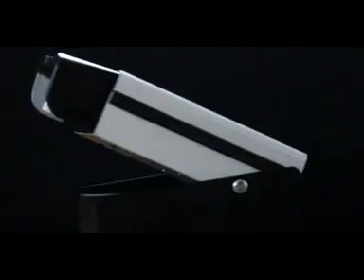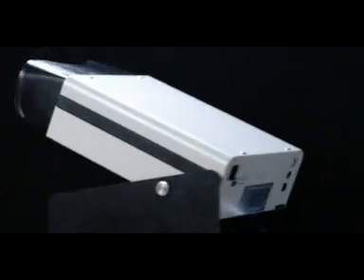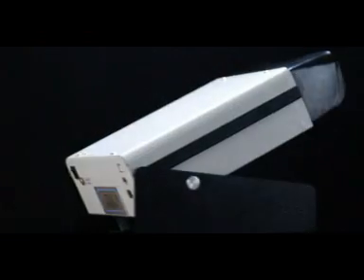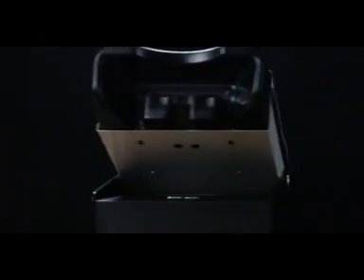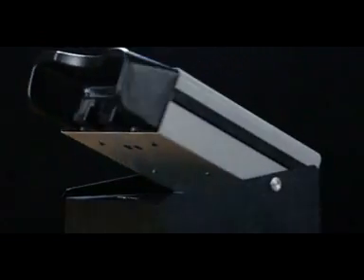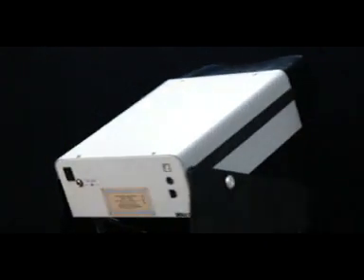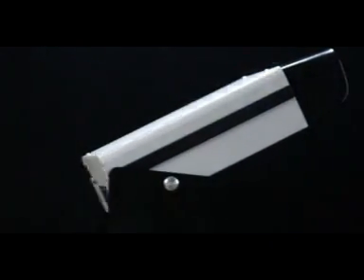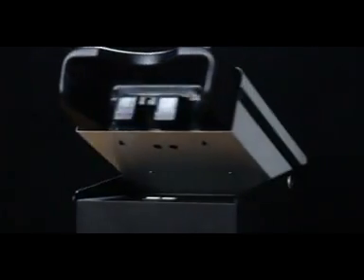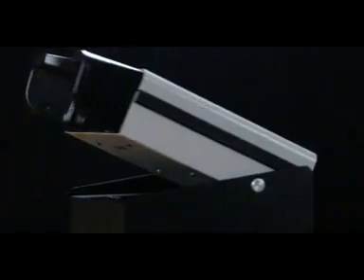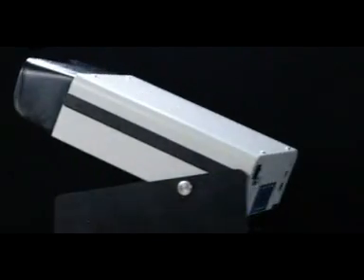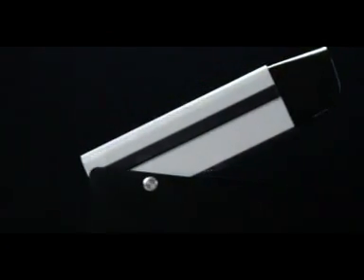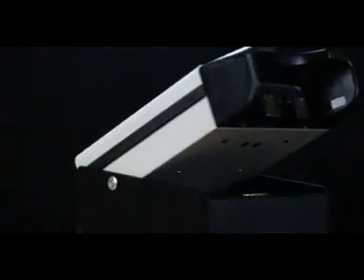The testing sequence demonstrated here is as per instruction manual. Test F1 on the VS5 machine measures the right eye for distance. Our employer will now begin test one with our participant Steve. The machine will automatically start with this test. The questions to be read out for each test can be found in the instruction manual.